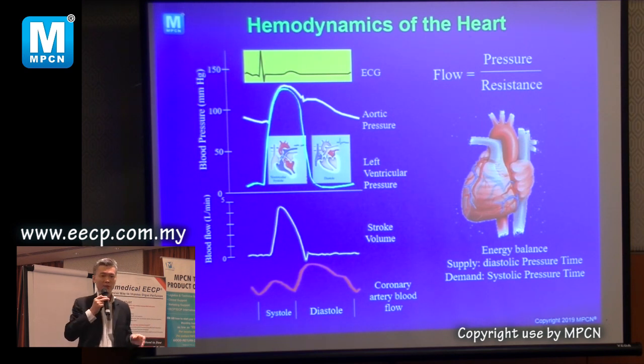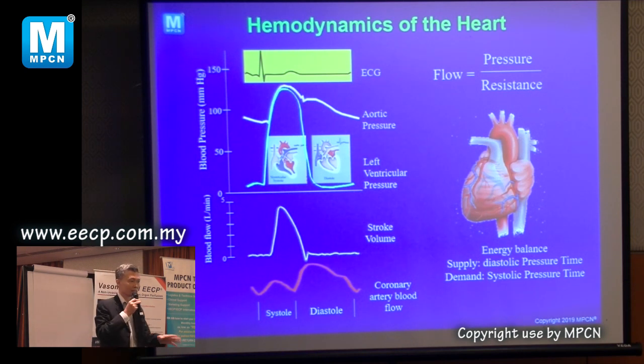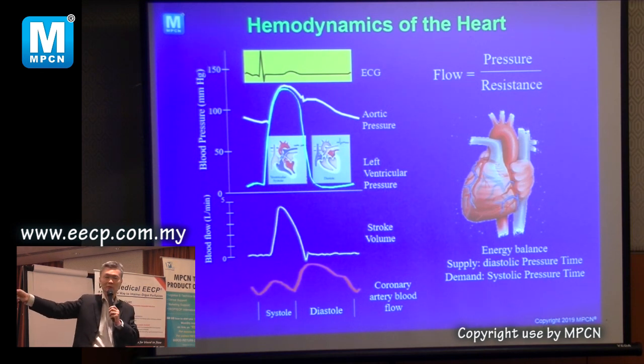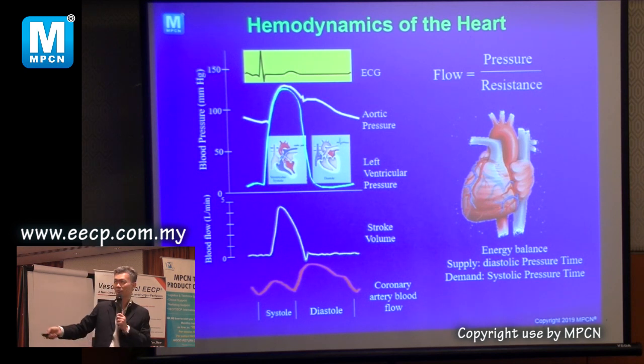If you put the ECG on a patient and you can't really see the spike, then the machine cannot detect properly. So you must adjust the location of the ECG. The standard one, they give you the ABC, same place. But everyone's heart is very different. You have to change the location until you get a big spike. If not, the machine will detect the small little one as another spike. So the trick is you must change location to look for the biggest spike, because the machine is triggered by the ECG.